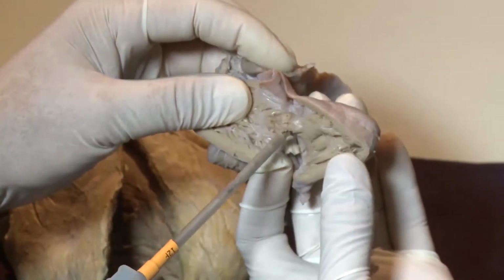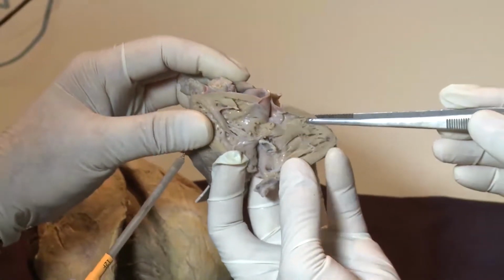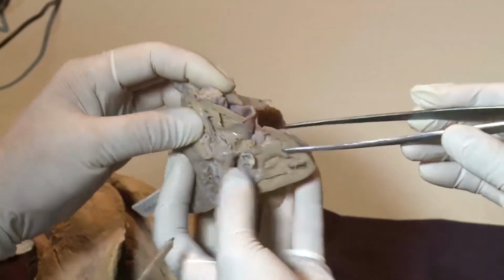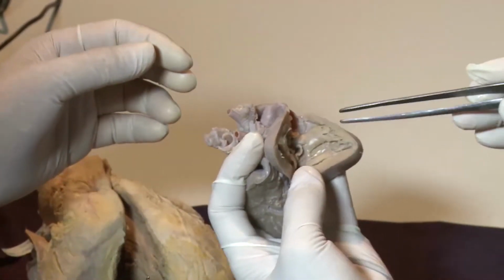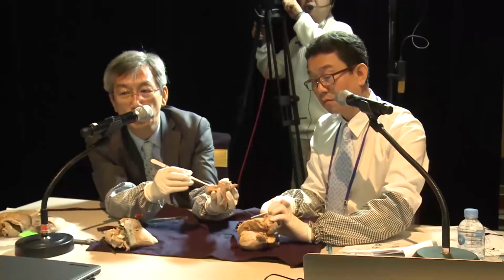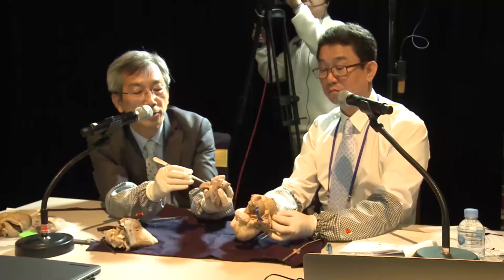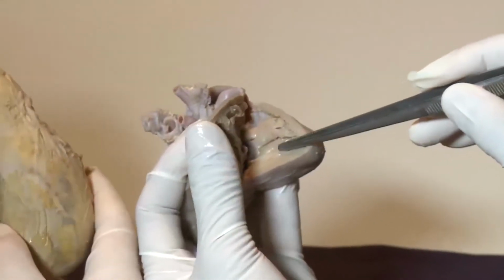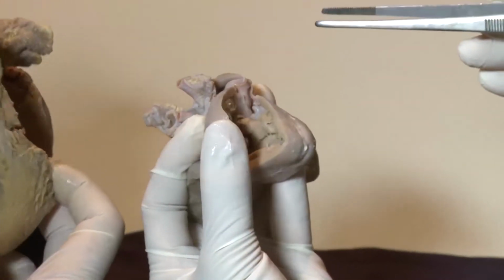Can we ask him to show us in this view where exactly the moderator band is? Sometimes VSD closure can cause some issues when you cross from the moderator. Moderator band is not a constant structure, but it's variable case by case. If it does block the device, it can be considered, but the moderator band itself is a free floating band between the septum and the free wall. So I don't think the moderator band is a great danger in any case.